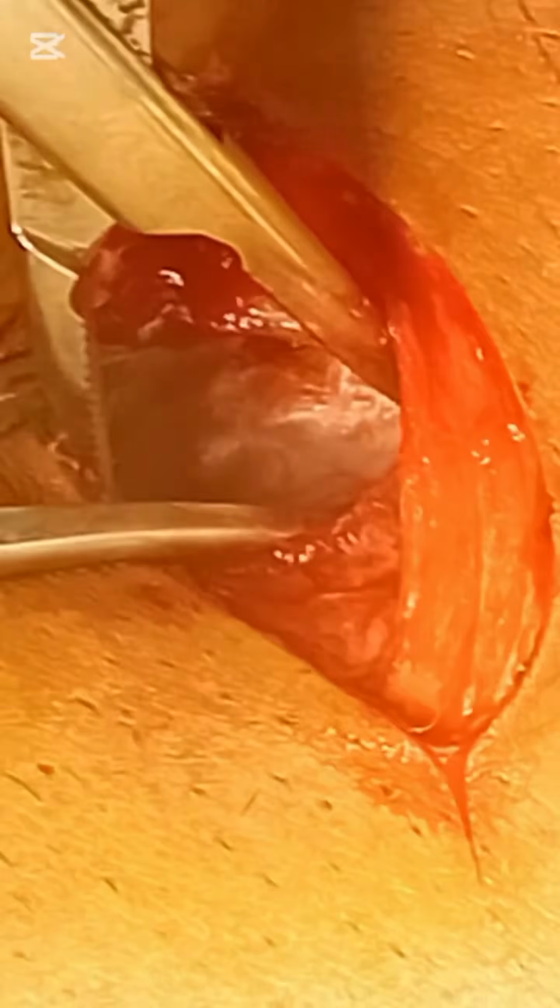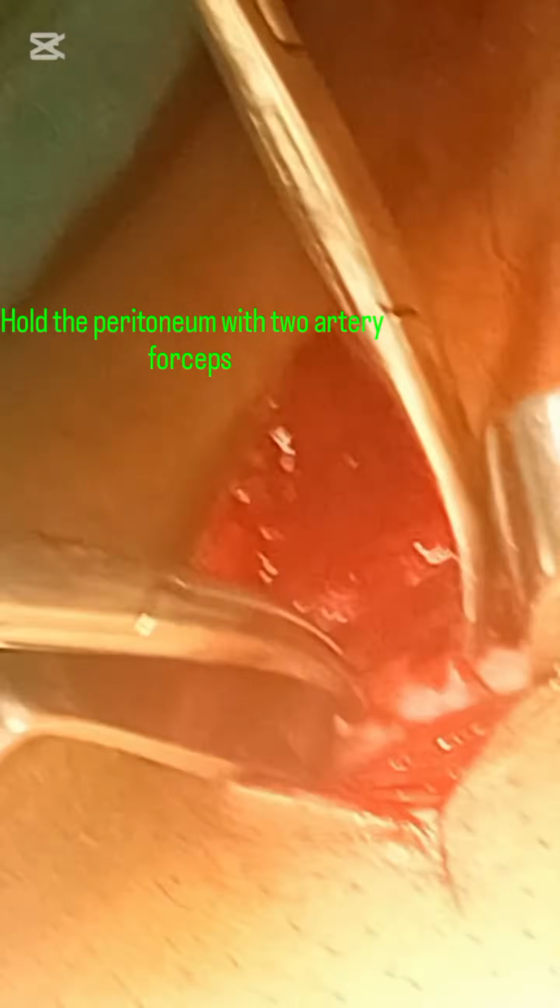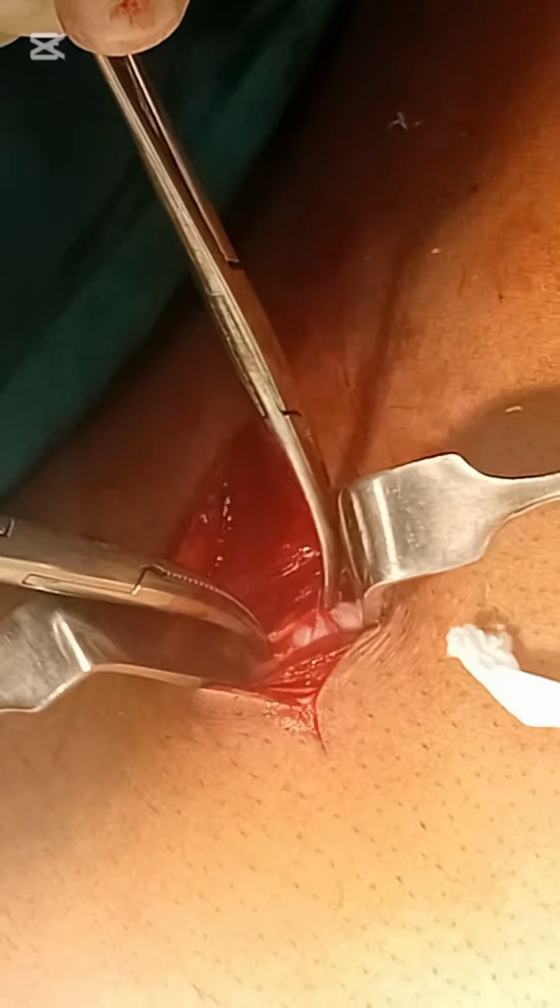Now we will separate the pre-peritoneal fat until we reach the peritoneum. The peritoneum appears as a glistening white layer. We will hold the space with right angle retractors. Now hold the peritoneum with one artery forceps, then lift it up with another artery forceps. You can see here both the layers of the peritoneum are lifted up.